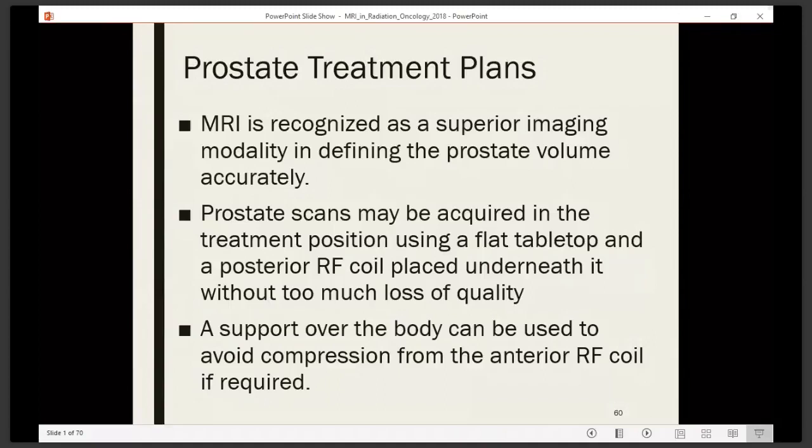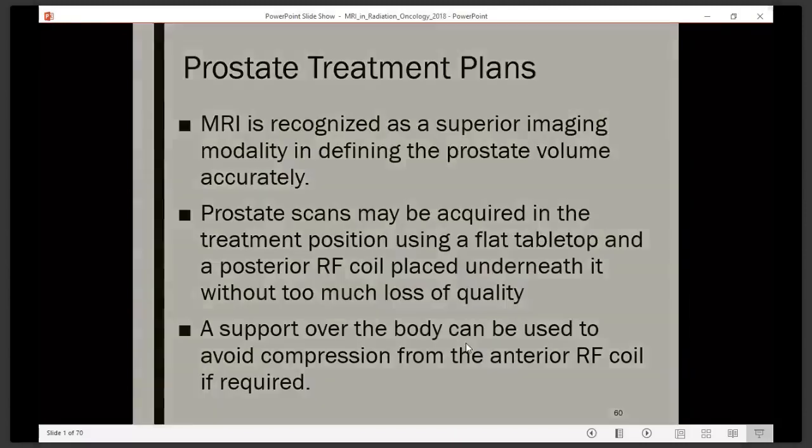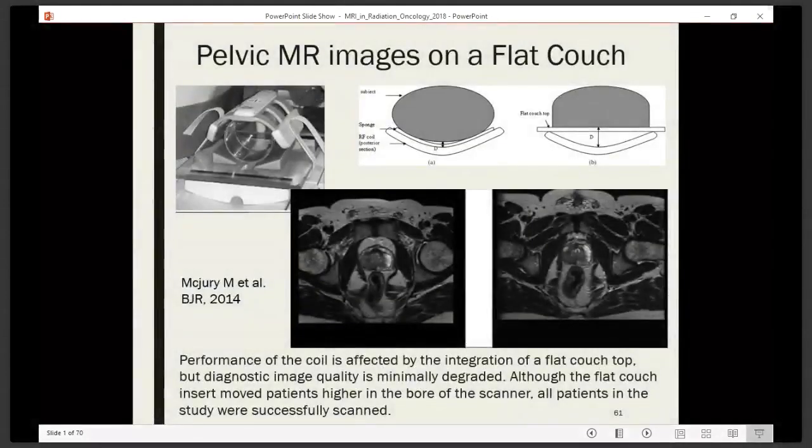In many diagnostic prostate studies, they use an intrarectal coil. It puts the RF receiver right up on the posterior portion of the prostate gland so they can get very good signal with that coil and therefore get high imaging resolution. And you really don't want to do that when you're doing radiation therapy planning because you're not going to have the coil in the rectum while you're doing the treatment.